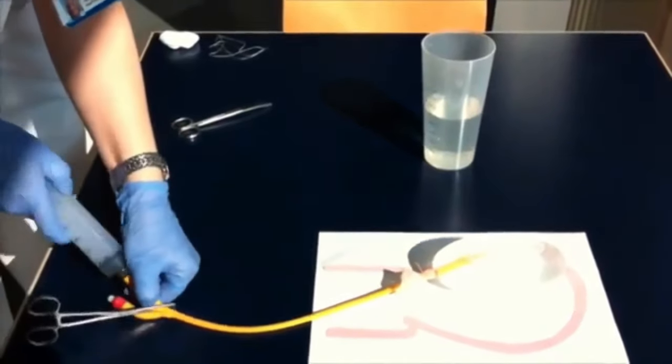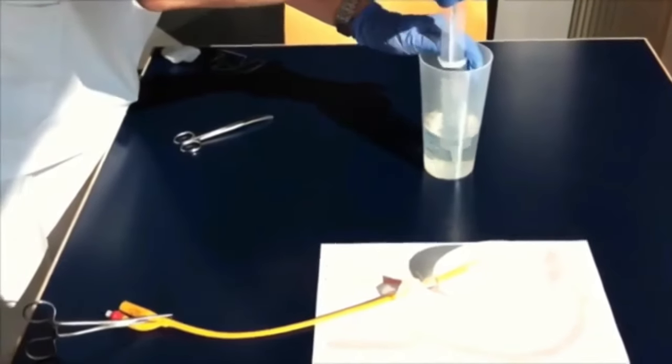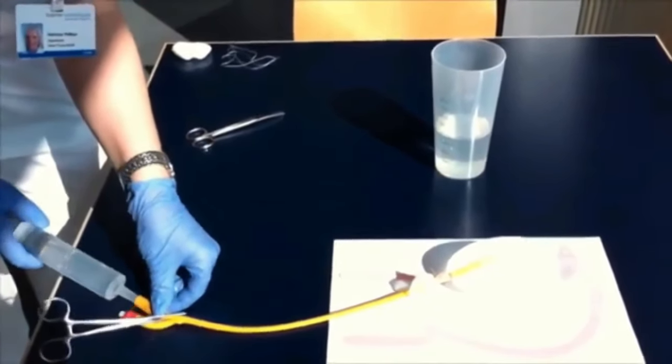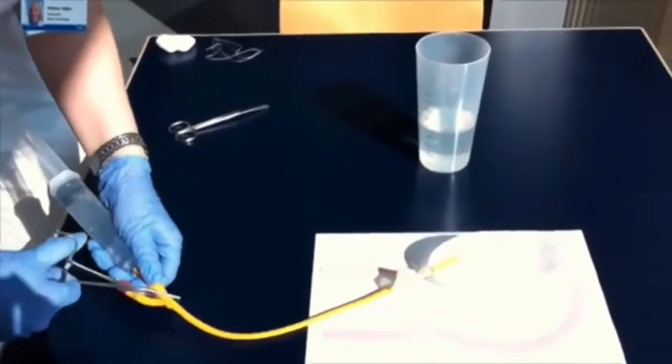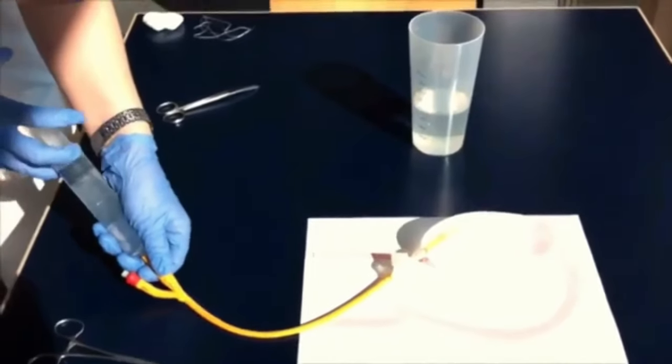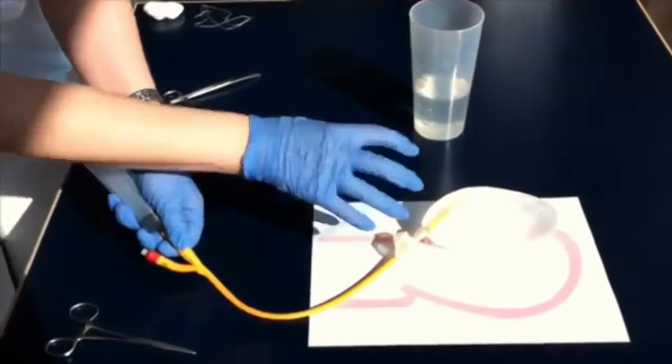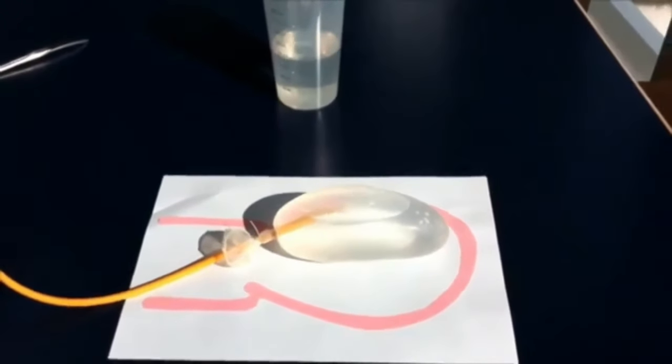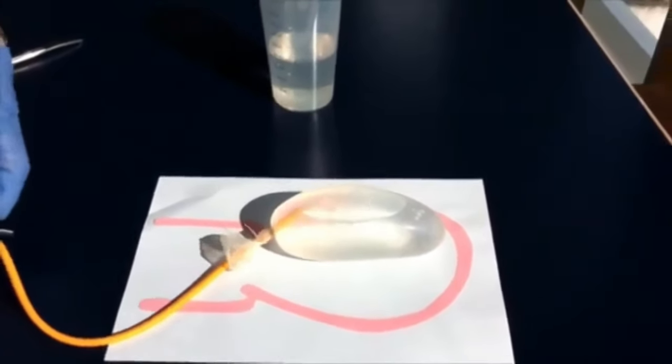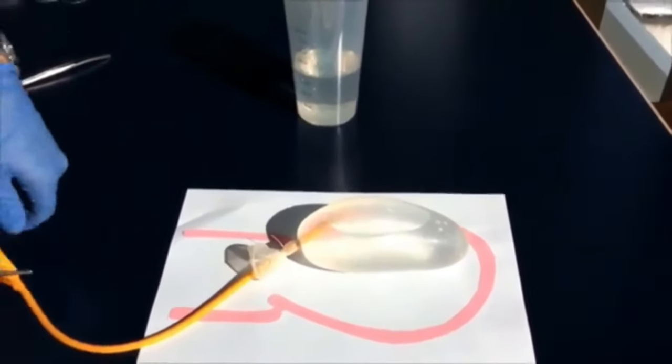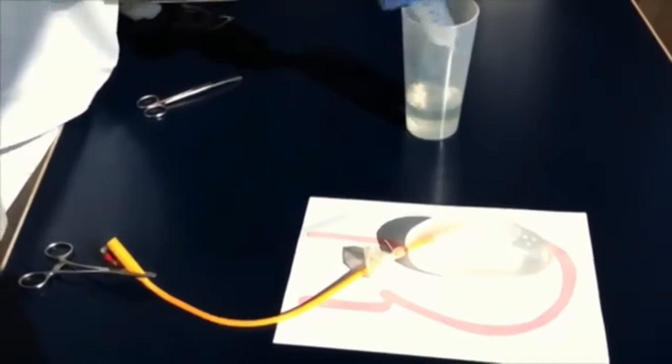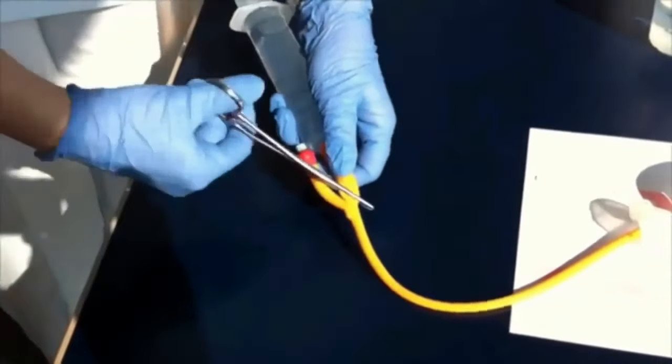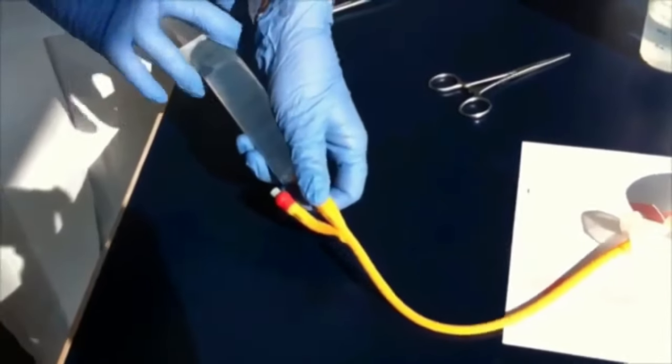This is another way of preventing ringer lactate from coming out of the uterus. Now you can see that the balloon is really inflated, and a pressure is being created. You will see that when you are putting fluid inside the balloon, all the fluid is going inside and bleeding will stop.